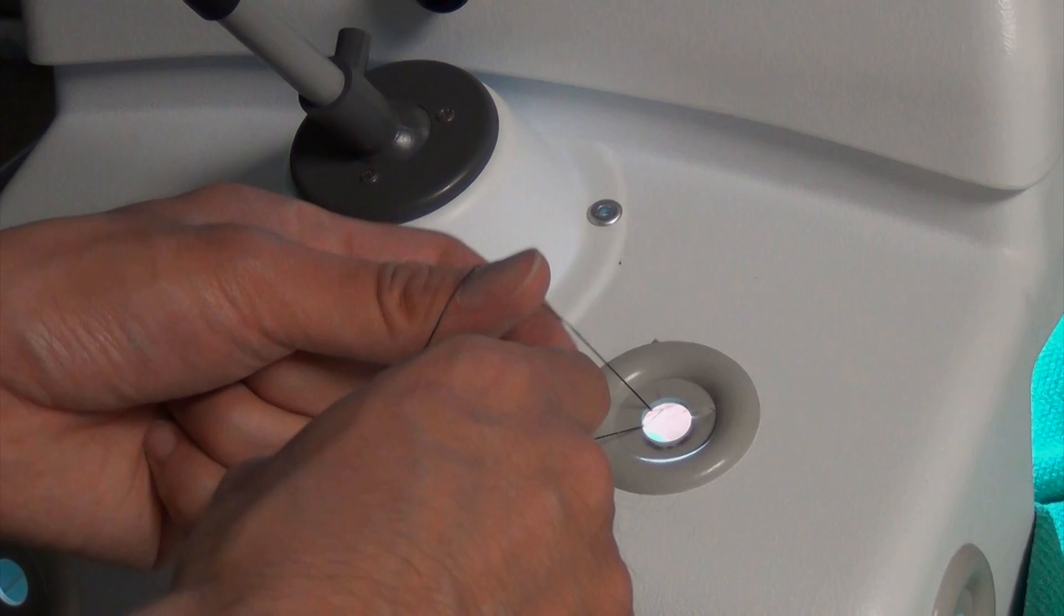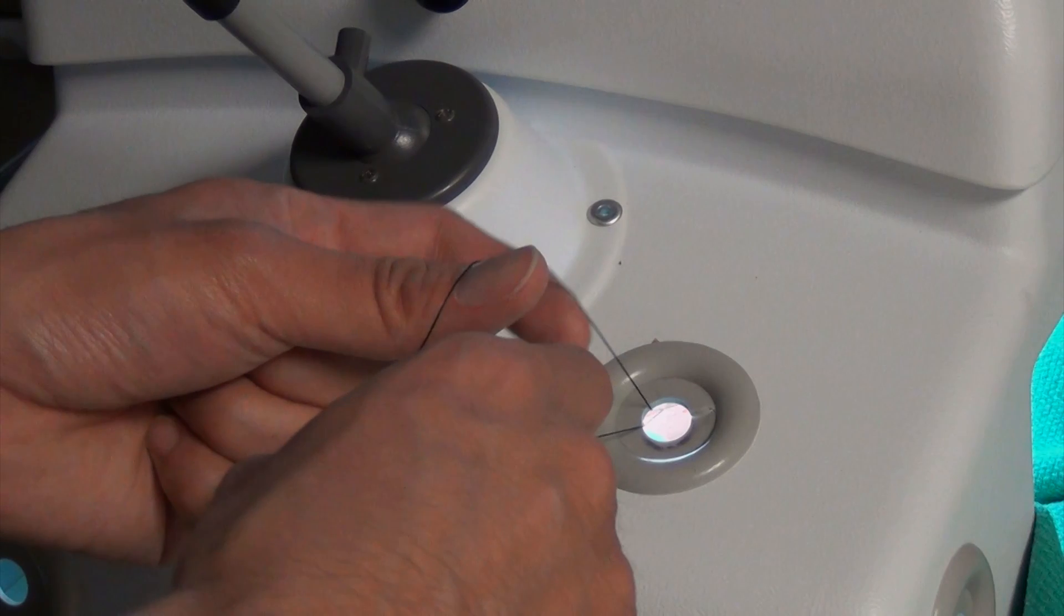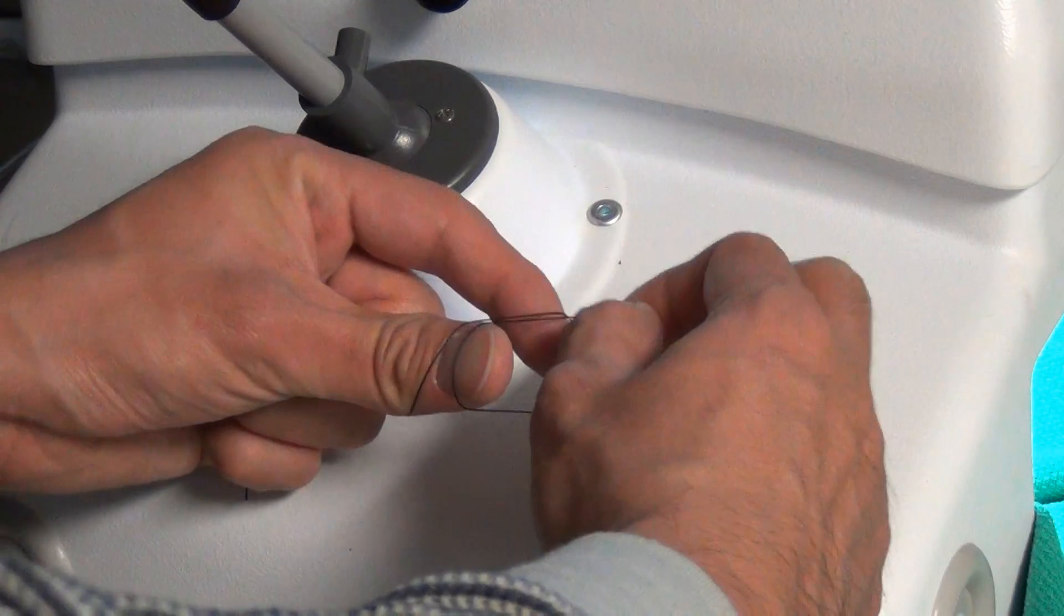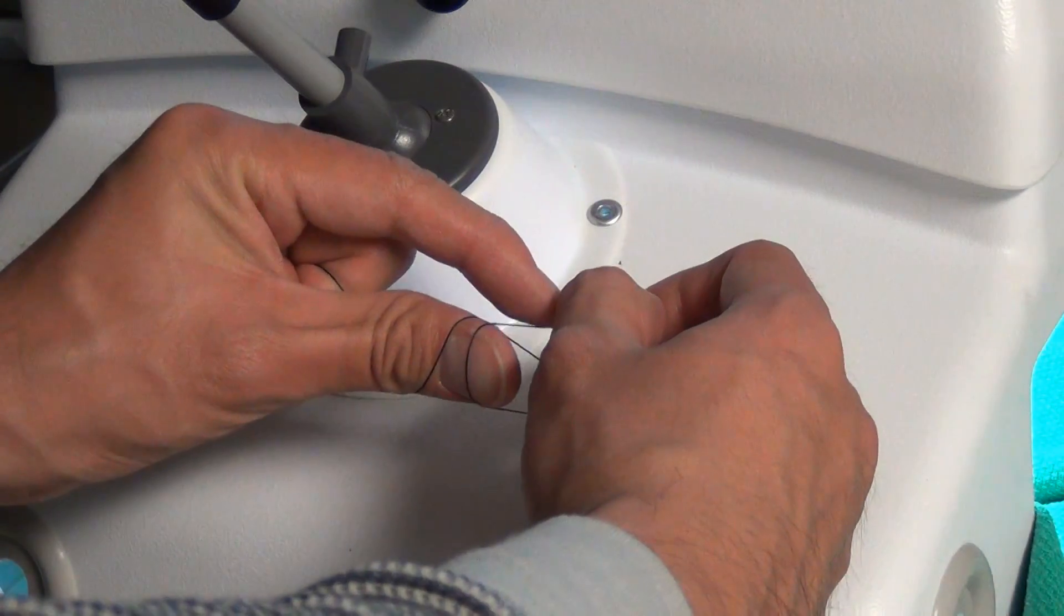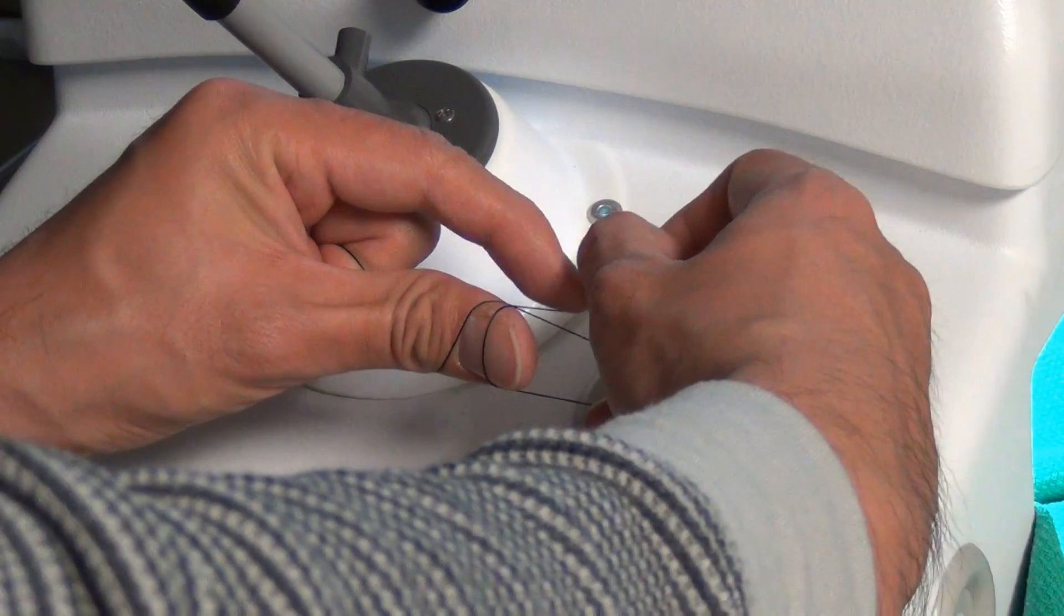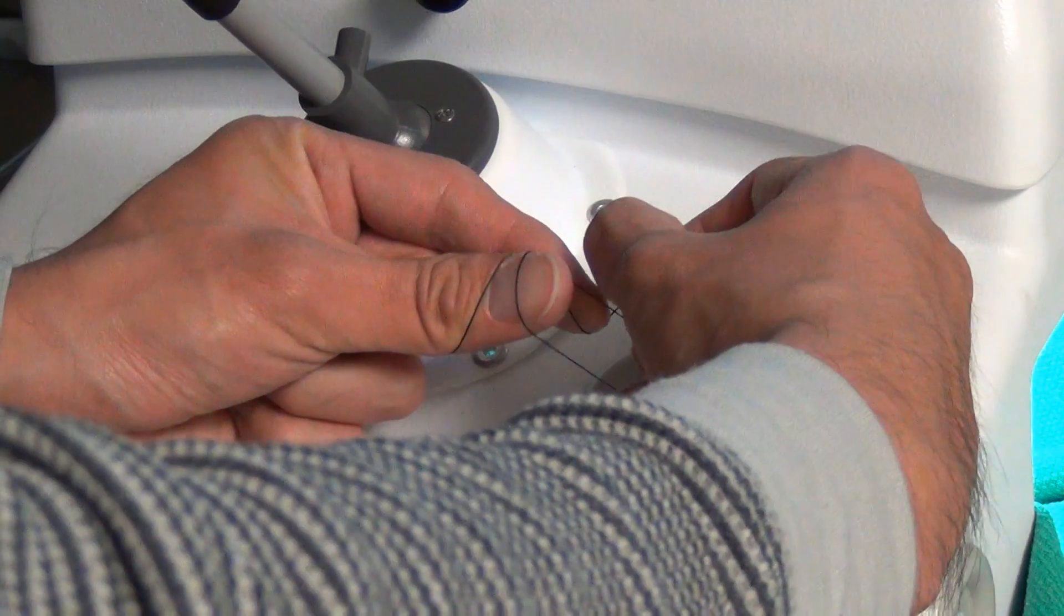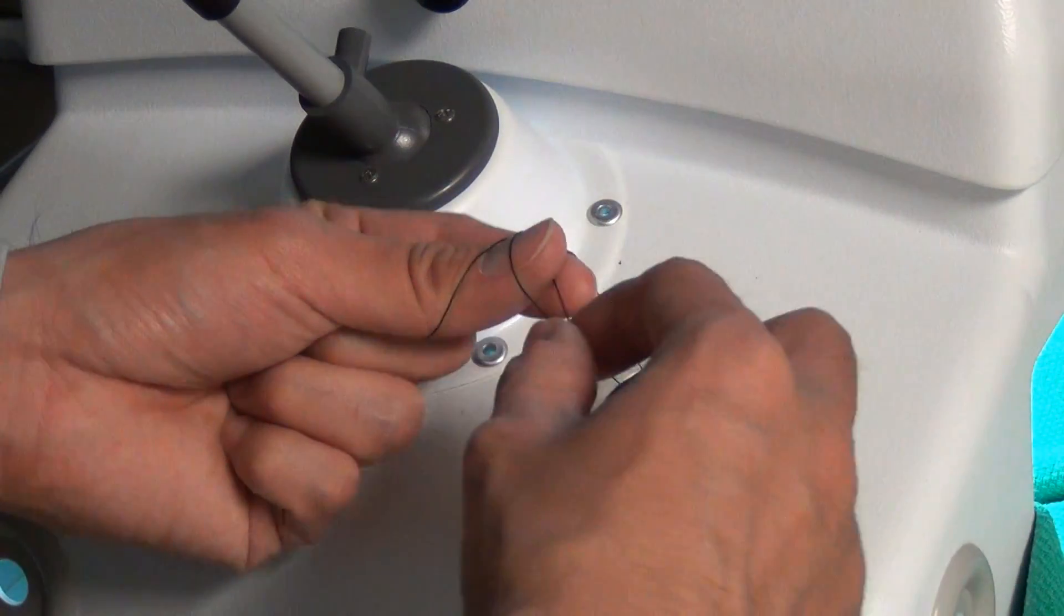Place the needle end of the suture over the thumb. Bring the tail end of the suture from below the thumb and wrap over the thumb. Bring the tail end of the suture lateral and underneath the needle end of the suture.